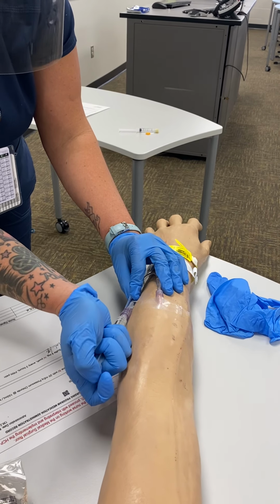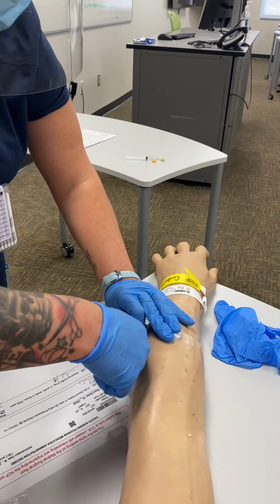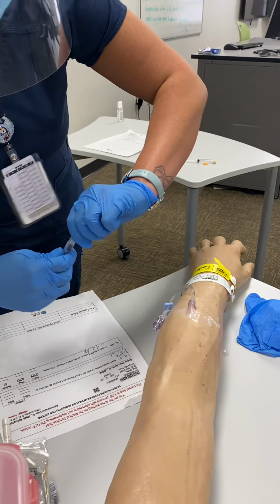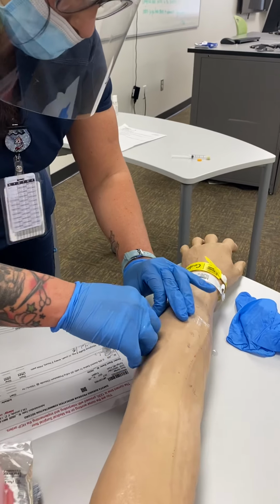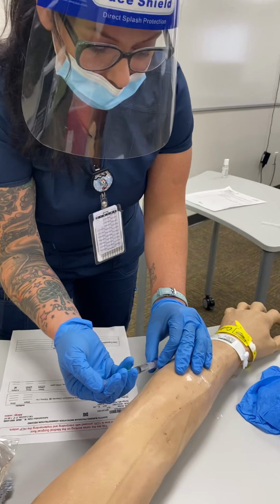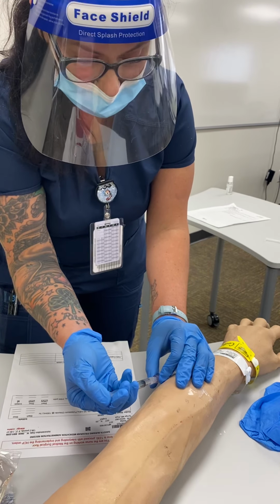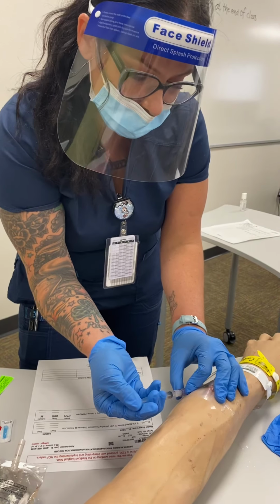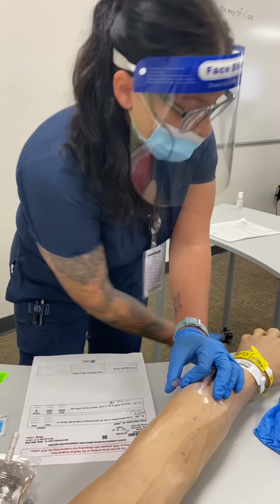Okay, so that's good. All right, so now we can go ahead and push our morphine. This is a slow push med, so you want to do about 1/4 ml per 15 seconds. But for video purposes, I am just going to push it in. But while I'm infusing, I want to make sure that I'm assessing the patient, I'm assessing the site, I'm looking for any adverse reactions to this medication. So you would never push that fast, but we're saving time.